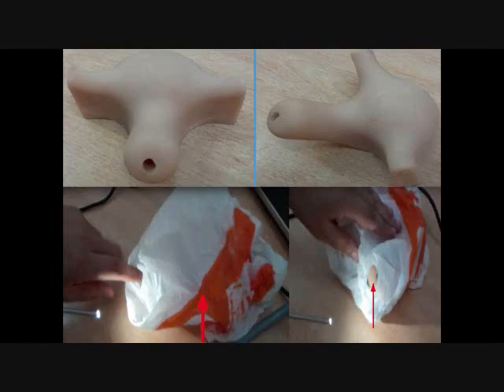And now we'll see another procedure, a beginner's one too. That was one of my first ones ever in an artificial uterus. I put it inside a plastic bag that I cut just to imitate the vulvar cleft and the idea of vaginoscopy. I wanted to get inside the uterus without seeing the cervix, like in real life. So there we go. Sorry for the scope, it was a little bit dirty. So it was a beginner's test, not one of an expert.